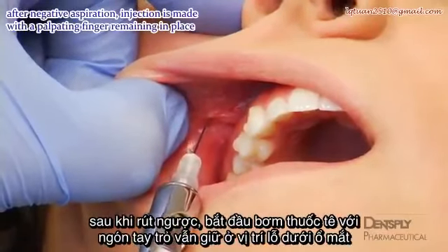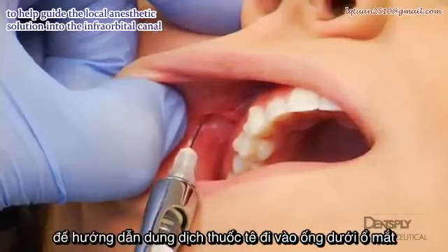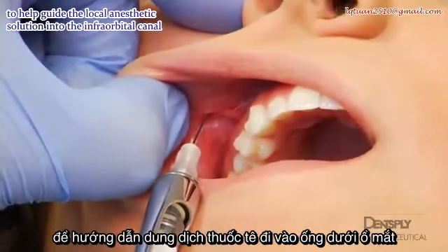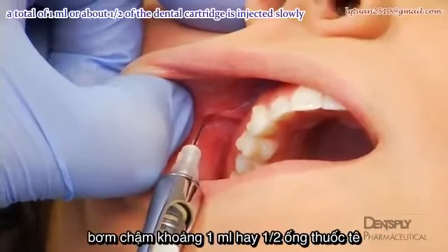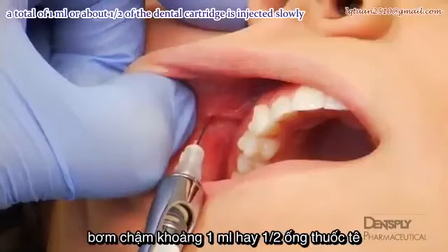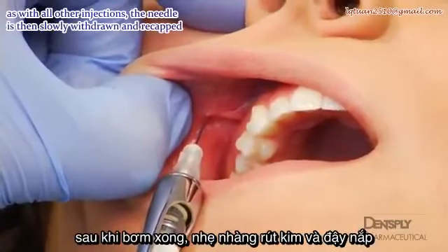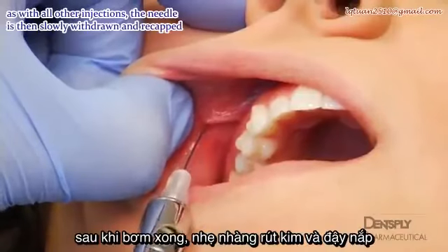After negative aspiration, injection is made with a palpating finger remaining in place to help guide local anesthetic solution into the infraorbital canal. A total of 1 milliliter, or about 1/2 of a dental cartridge, is injected slowly. As with all other injections, the needle is then slowly withdrawn and recapped.